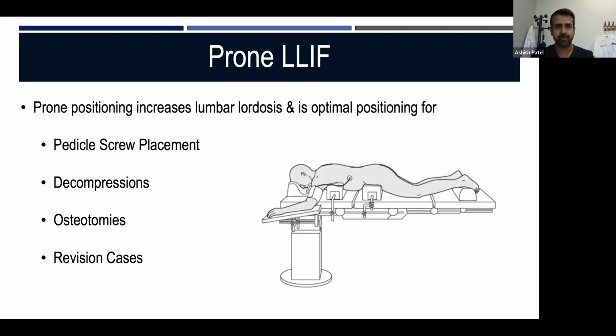And I perform single position lateral surgery. I think it's an elegant solution when we're thinking about L5-S1 or L4 through S1 in a virgin case. But there are often times in my patients where I need to revise hardware, perform osteotomies and decompressions, and place pedicle screws in a multi-level construct. And so for me, the ideal position to perform that in is the prone position.